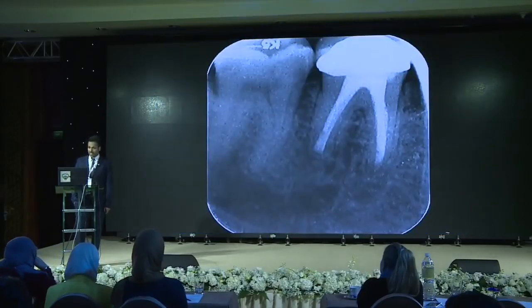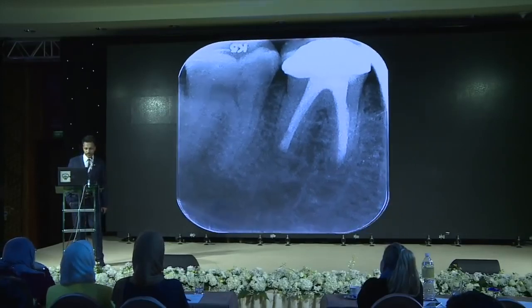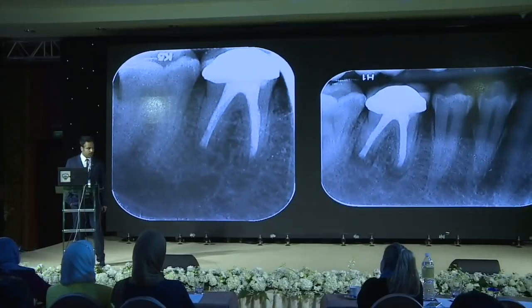So I texted him back on LinkedIn, and I told him, can you come to the office so we can take a radiograph? And he came, and this is the post-op. After 4 months, the bone completely healed. And this is how it was compared to the post-op radiograph.